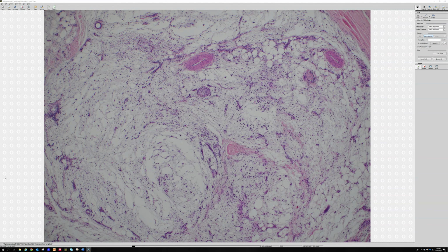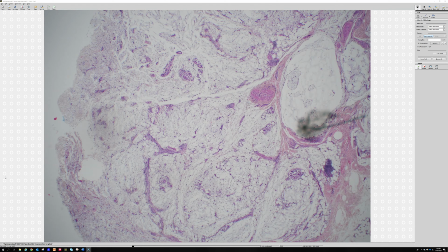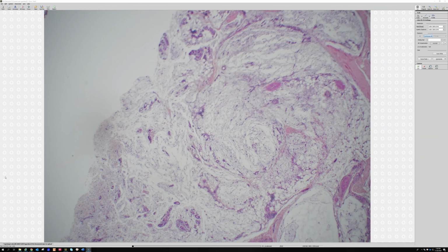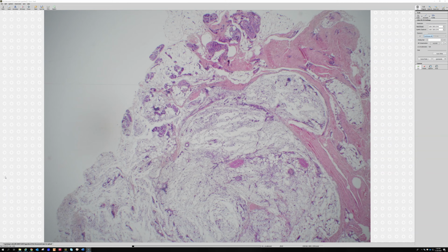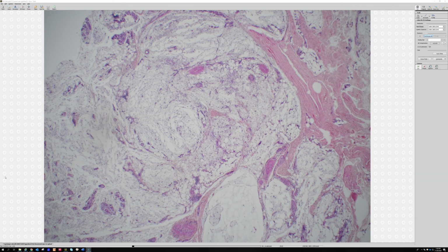The important thing to remember about myxofibrosarcoma is, number one, it is actually relatively common as sarcomas go. I mean, all sarcomas are rare, but this is much more common than many of the other types of sarcoma. I see this regularly, sometimes several times a month. It usually is on the extremities of elderly people, and about half of the time it arises above the fascia. That means in the dermis or subcutis. So it'll show up in dermpath and in other areas where people are maybe not expecting a sarcoma. It can grow in the deep muscles too, but it has this tendency to involve the skin.